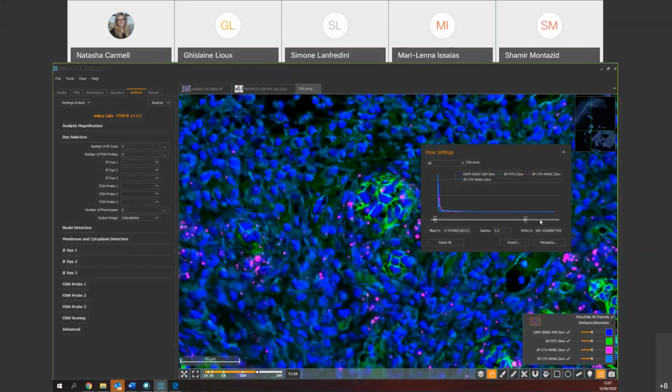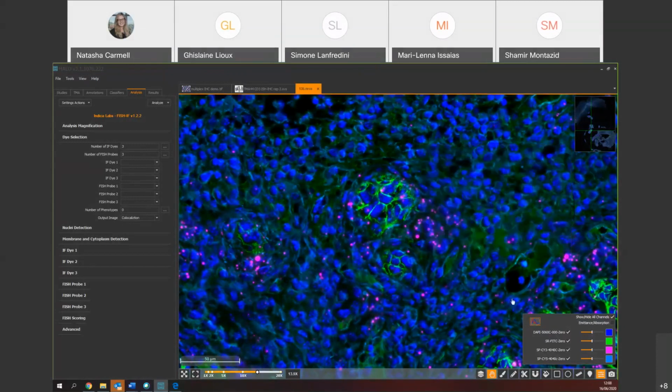And this is actually quite good if your image is not maybe rendering really good detection, maybe for your eye, you can always change these parameters. And bear in mind that you can set these parameters as you see fit, because it will never change your image, but just the way you can view it. So you can change this as you wish.